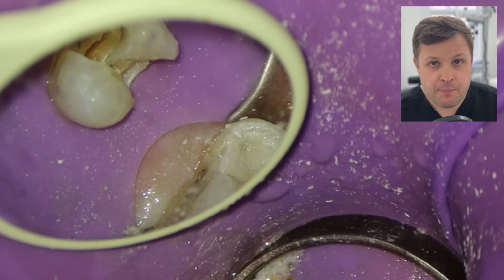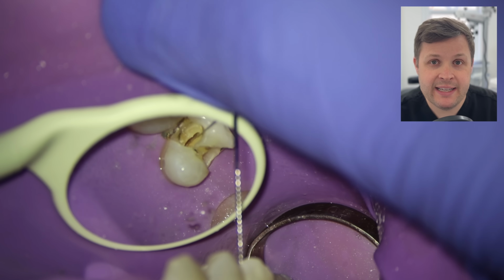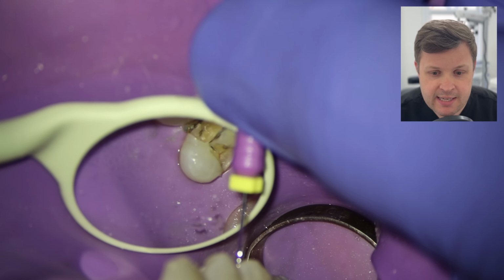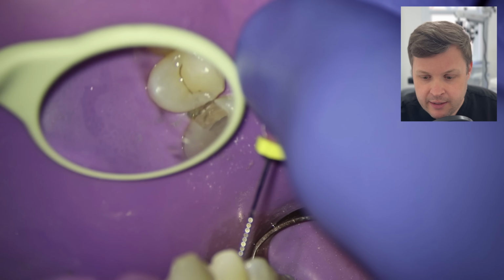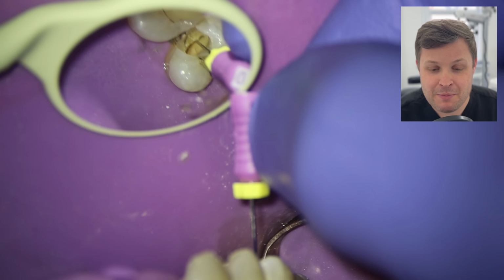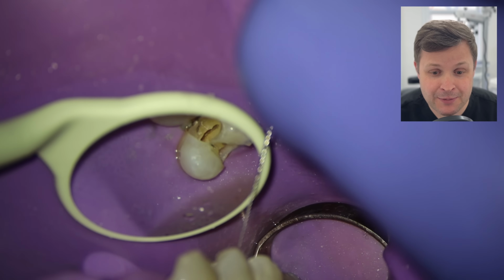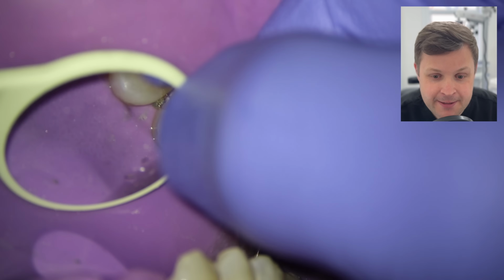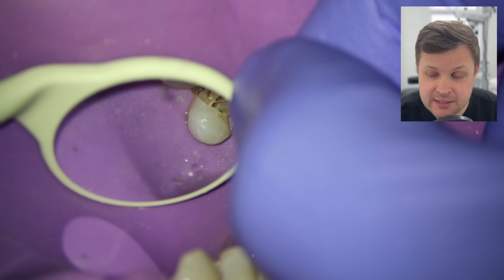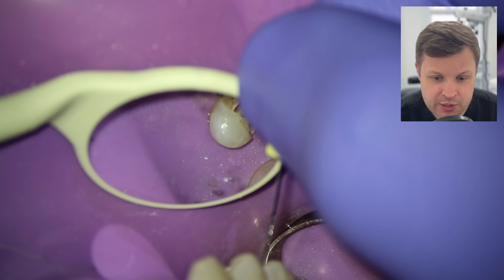So at this point, I'm looking at the canal orifice, and it's looking pretty wide, as if it's either ribbon shaped or maybe there's two canals. I'm not entirely sure. Obviously, the problem of me determining if there's two canals or not is compounded by the fact that there's a huge bridge of dentin and enamel in the middle, and I suppose in a way, if you're not confident, doing this kind of technique can make life much more difficult for you.